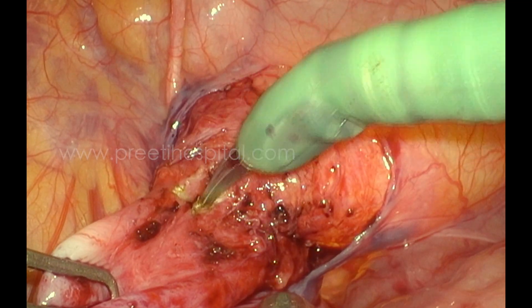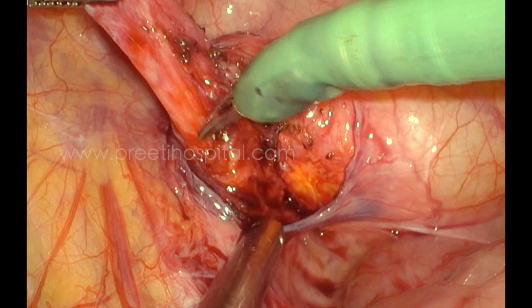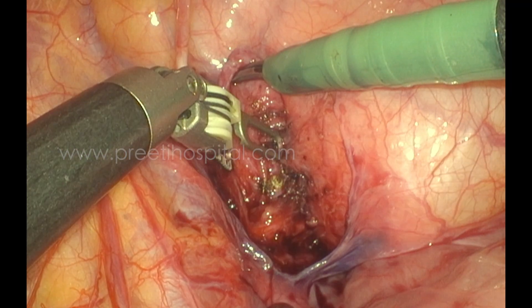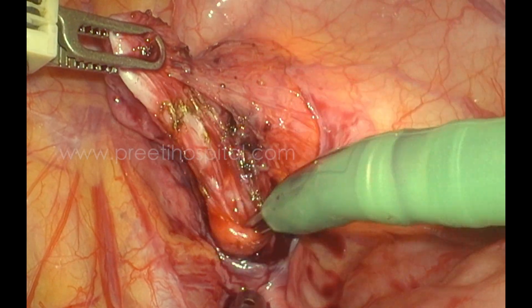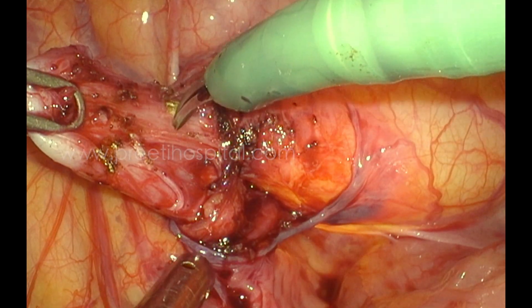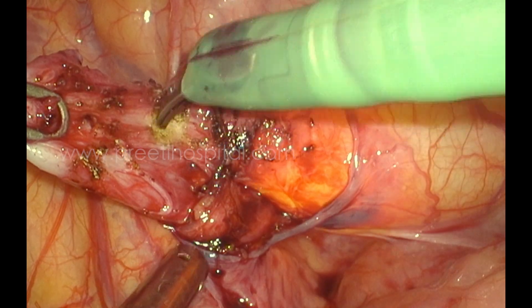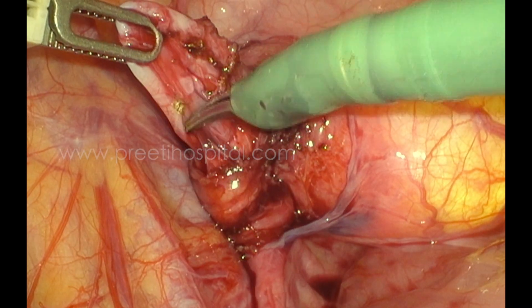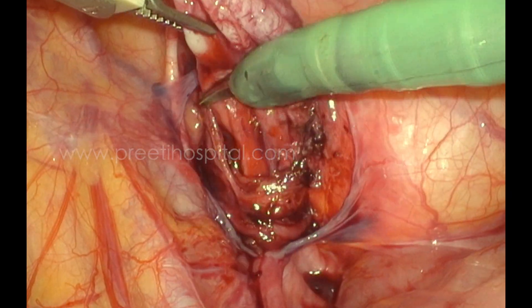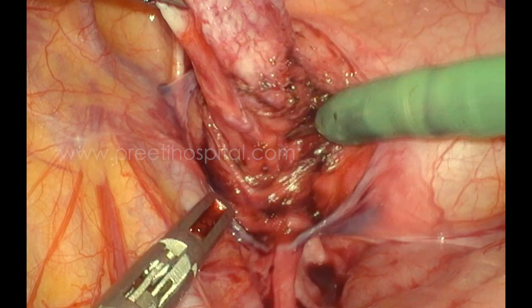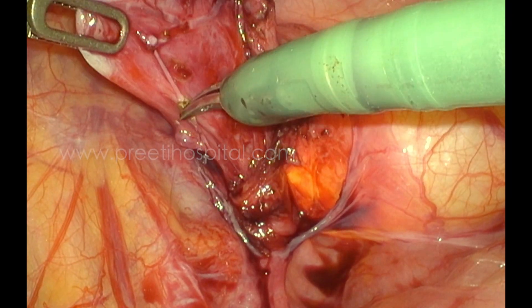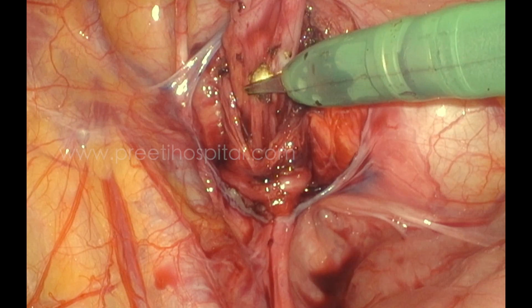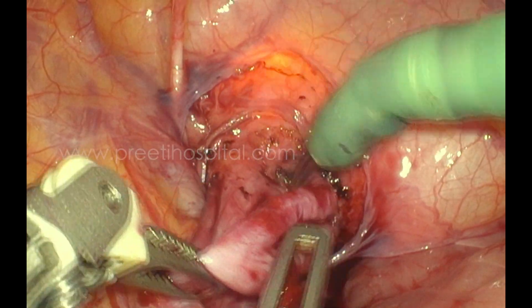On cystoscopy we visualized the diverticulum neck, approximately 3–4 centimeters, giving us a clear idea of what we are doing. The important thing when cutting around a diverticulum is that all-around dissection is essential so that you do not cut the detrusor or surrounding structures like the ureter. We maintained patient dissection all around the diverticulum, separating tissue gently and reaching the neck.